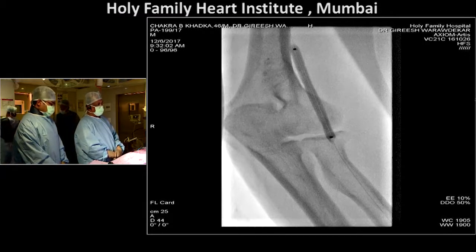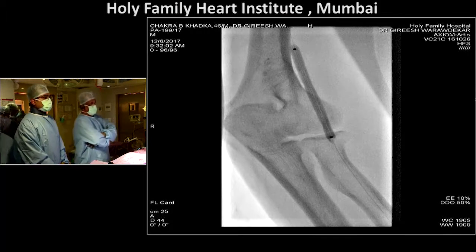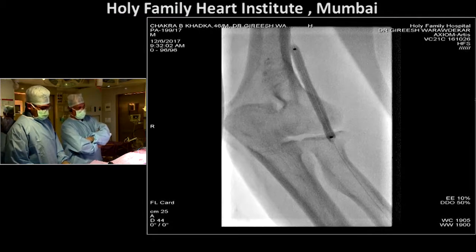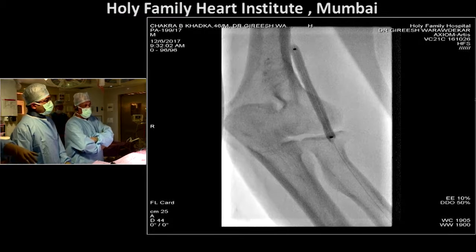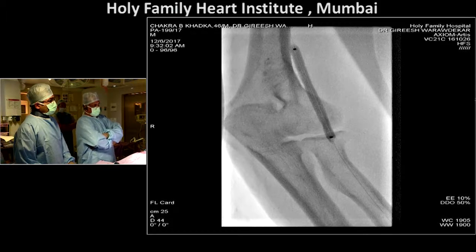Yeah, Gireesh. I'll just throw out a question to the expert panel. Suppose in this situation you had a recoil. What would be your next goal? Would you put the patient through surgery, or would you think of putting one of those biomimetic vasculomimetic stents? What would one do? So if there was a recoil here, what would be the next thing?